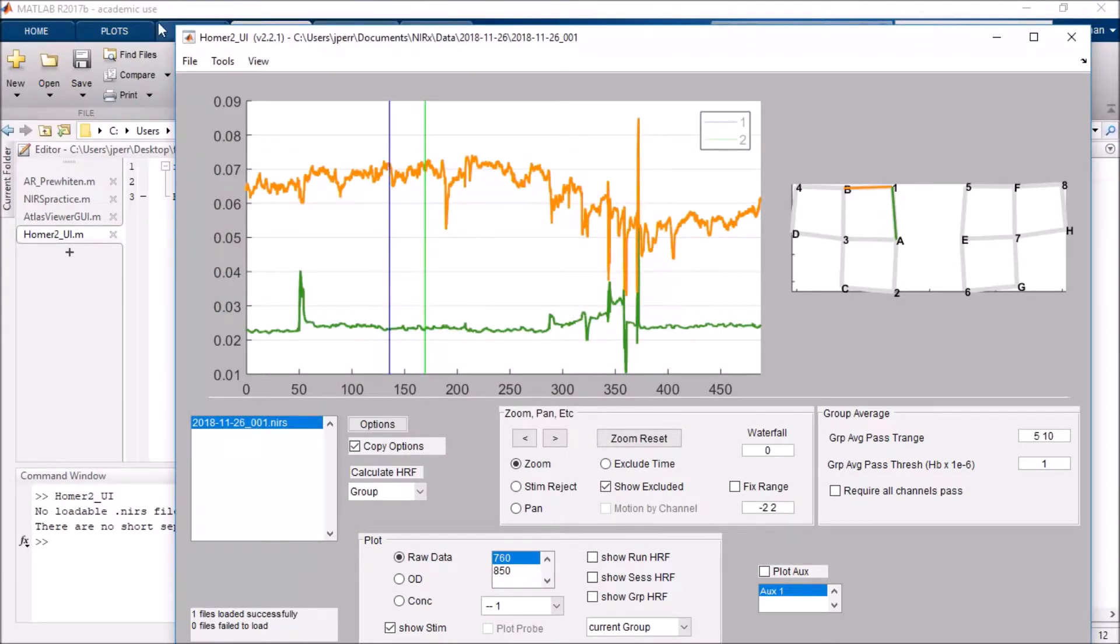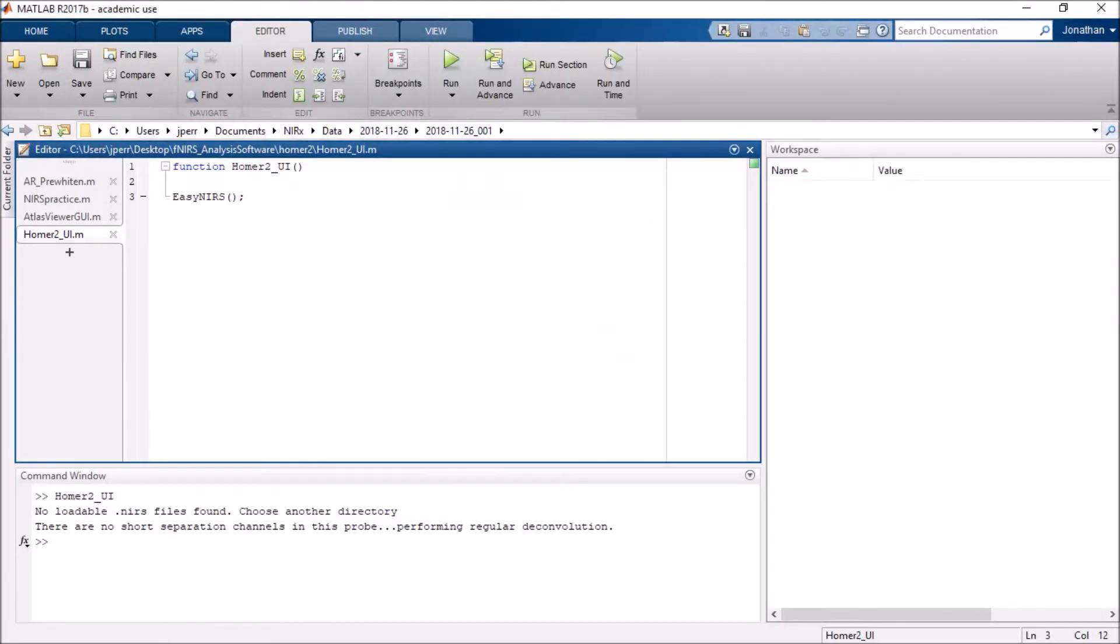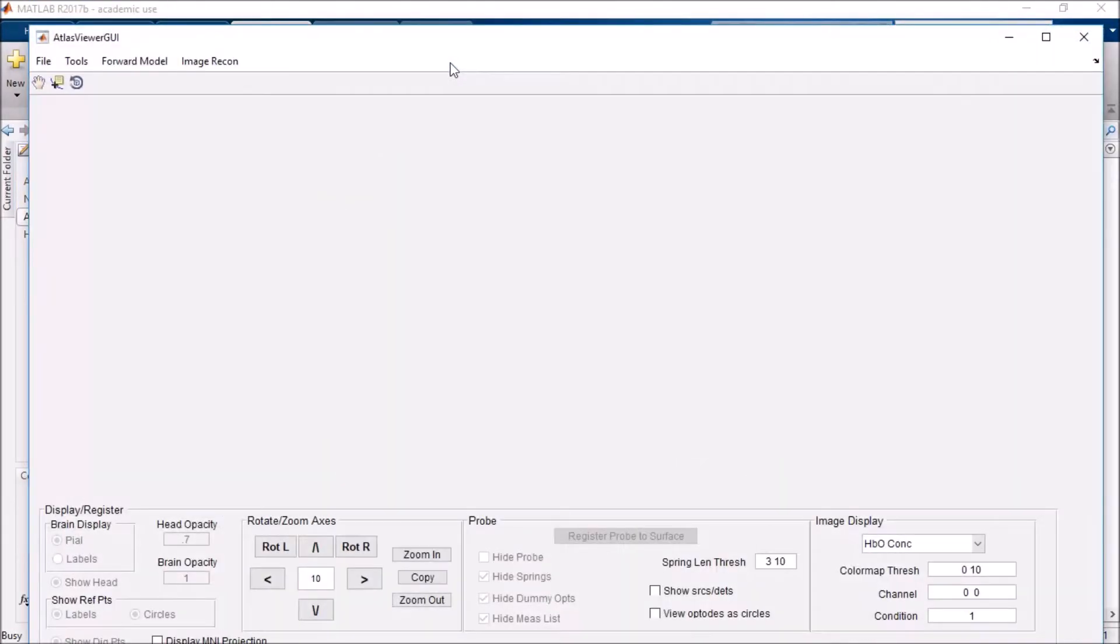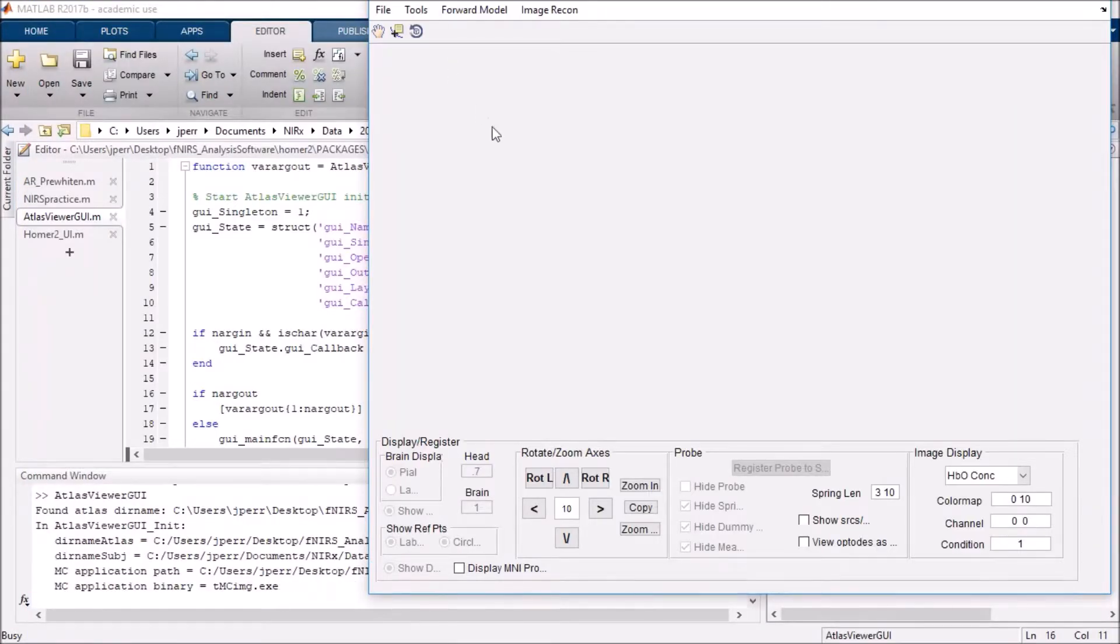From there, I have everything I need. So I'll go ahead and go to my Atlas Viewer. Open that up. And you'll see I'll just hit run. And here we go.